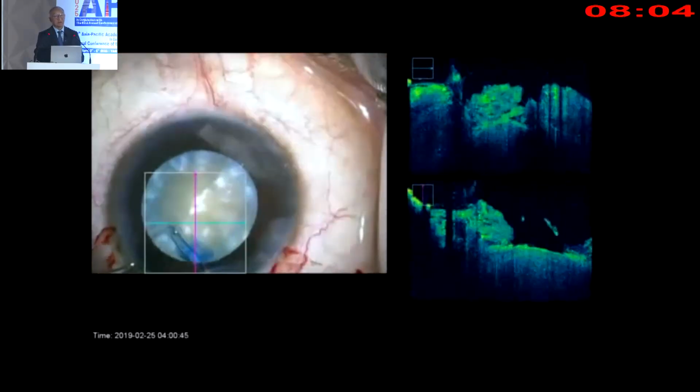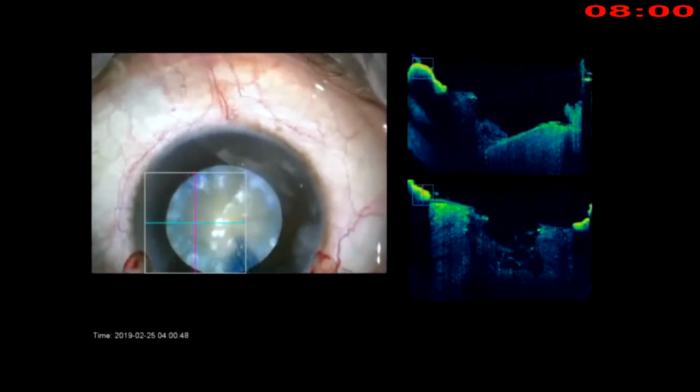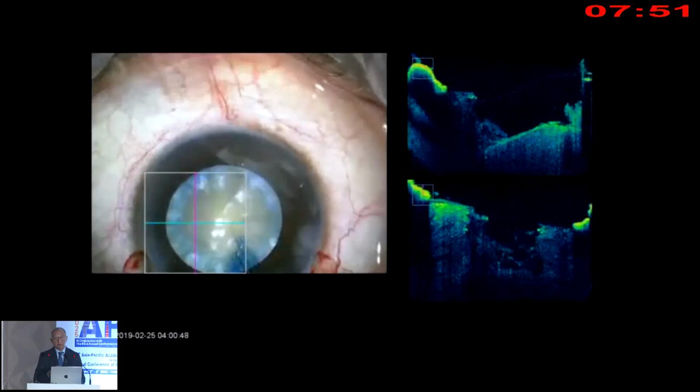Now you can fashion the rhexis accordingly, comfortably, with micro forceps or a needle also, to a size where you can do a nice nucleotomy and implantation in these cases. The thing to learn here was that if you have thick fibers, needle aspiration may not work. There you have to break these fibers, so you require a larger aspiration with cannulas.